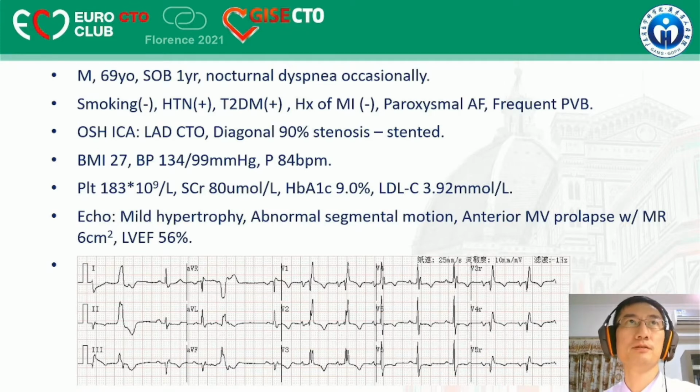This is an elderly gentleman with heart failure-like symptoms and poorly controlled risk factors. Echo shows abnormal segmental motion, but the LV ejection fraction is still preserved.